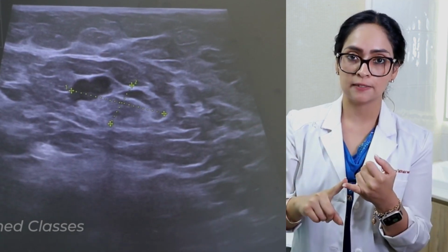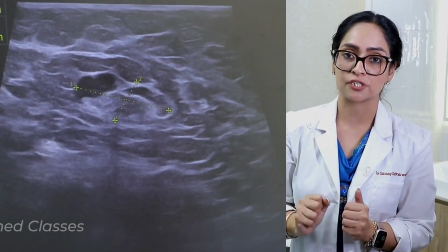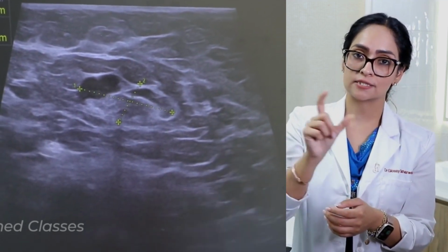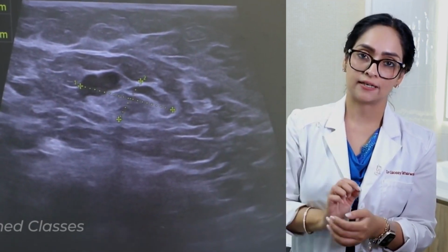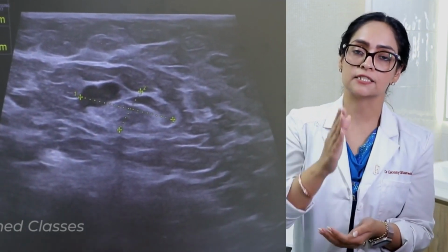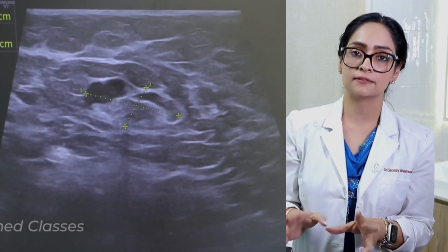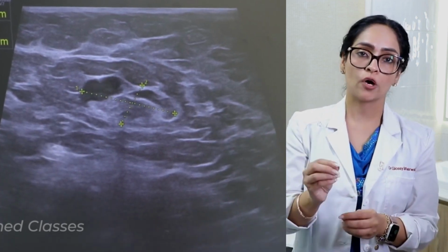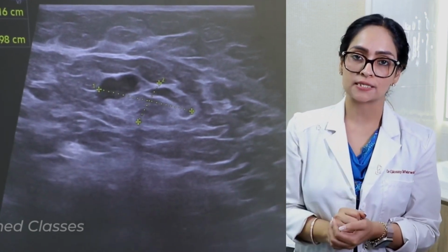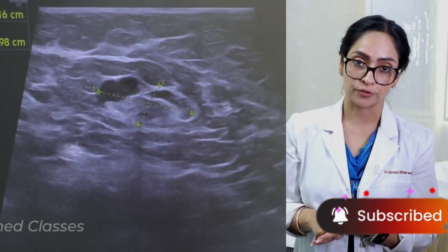So this lymph node is enlarged, but how will we report it? That there is a breast mass seen and there is an enlarged single node in the same axilla, right or left, whichever side you are examining. And you will say that the node is enlarged, measures this many mm, with maintained fatty hilum or lost fatty hilum. Lost fatty hilum tells us directly that this node is involved in malignancy. If the fatty hilum is maintained, then we can still think that maybe the node is not involved, or it is not seen as a frank involvement of the node. Anyway, after excision biopsy, we do sentinel lymph node biopsy to see the involvement of the node.